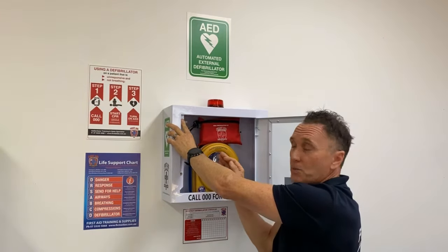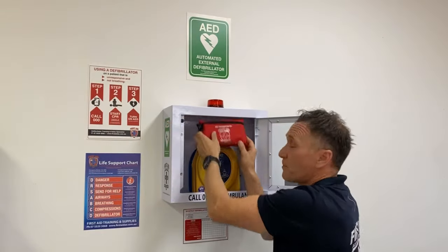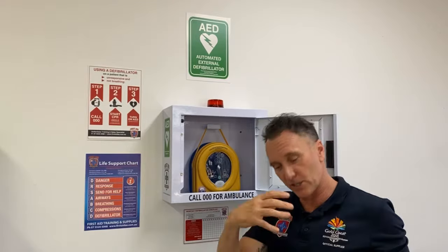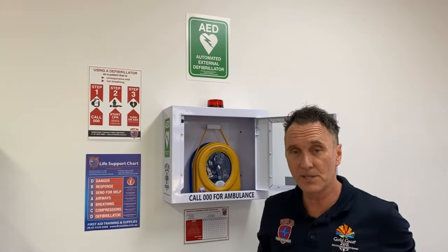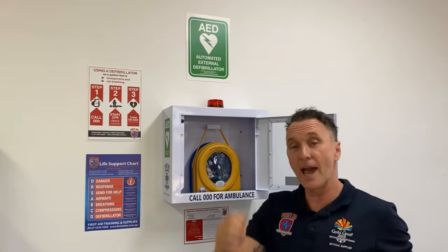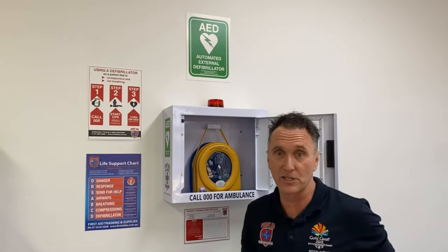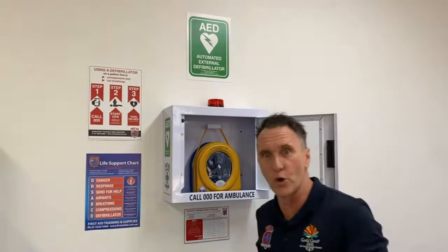We also have the patient prep pack which allows you to access the patient's chest with shears, gloves, a CPR face shield, and a surgical razor to allow you to remove the hair from the patient's chest so the defibrillator can work effectively.